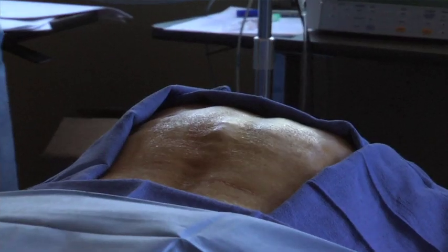We're going to talk about vertebroplasty today and we're going to show you an actual procedure and walk you through that procedure. Vertebroplasty is a simple outpatient procedure that is typically performed within 30 minutes. It is usually performed with light sedation.